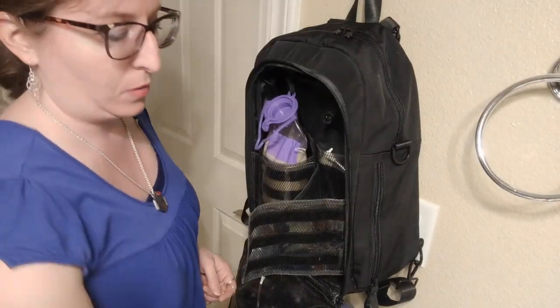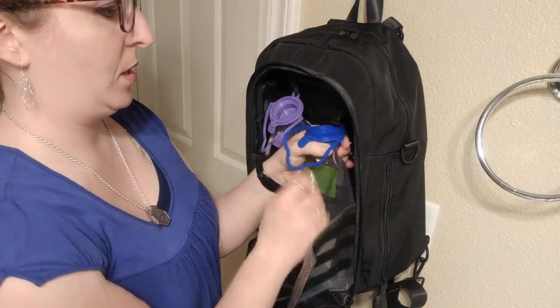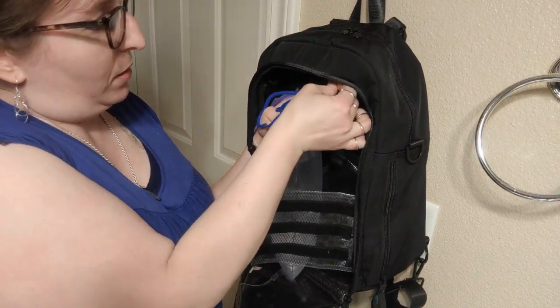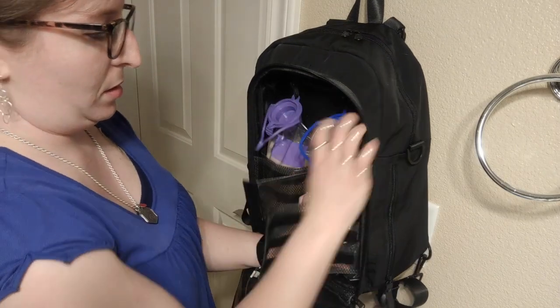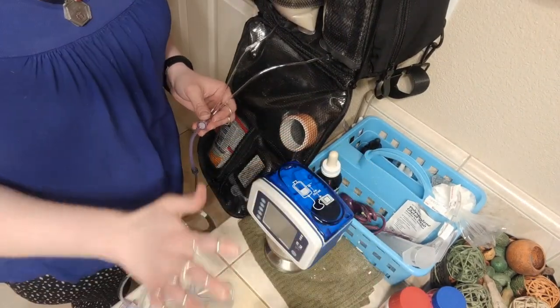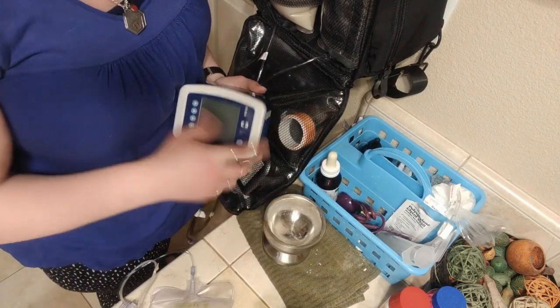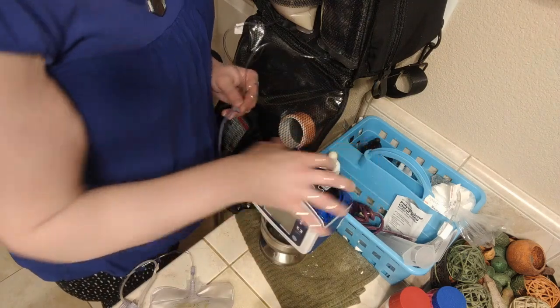So, back to that. Now, do flush. Snap it. Put that back on and lock that there. And tuck it. Okay. Now, what I usually do, this is kind of my med station. It's a little messy and chaotic, but this is the mortar and pestle that I use to crush all my meds, and it's kind of just the right height, either this or on my caddy right there.